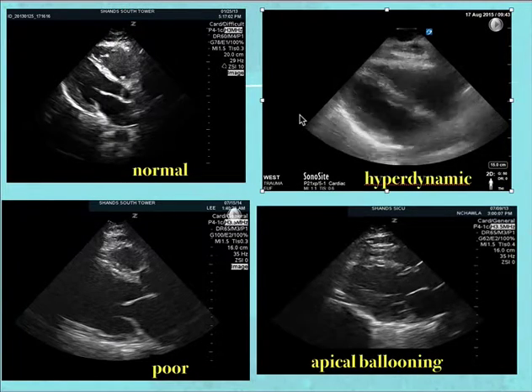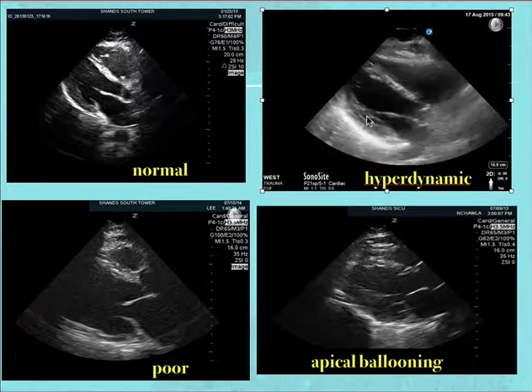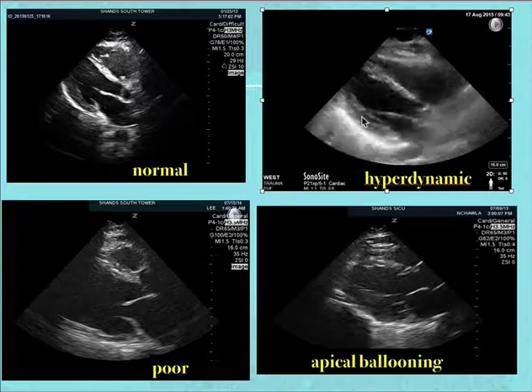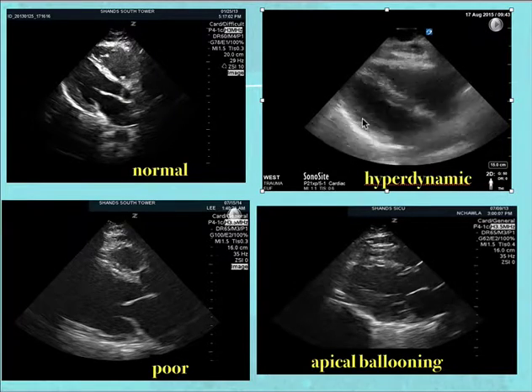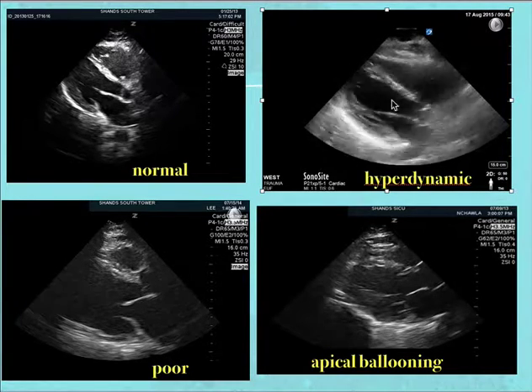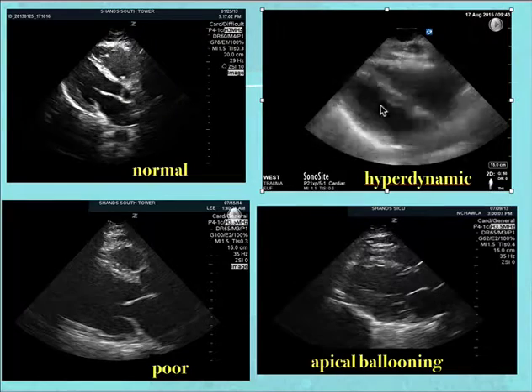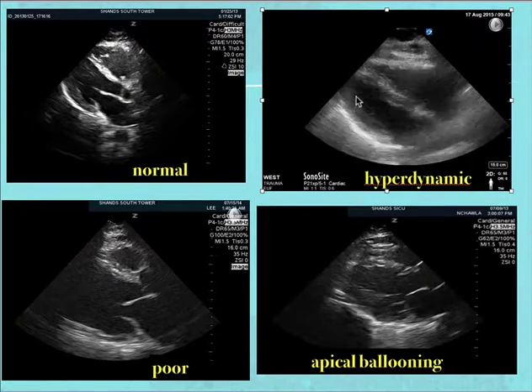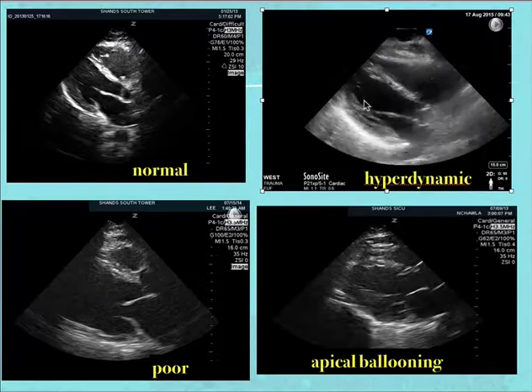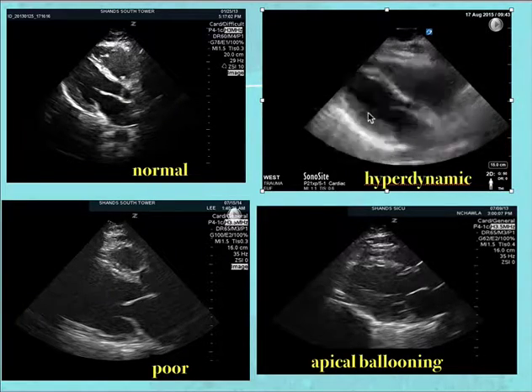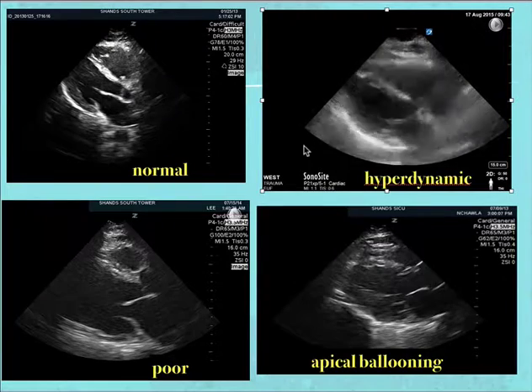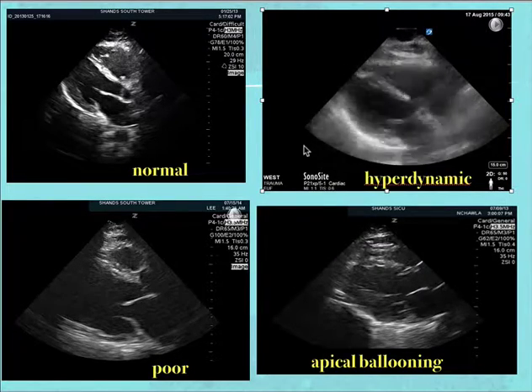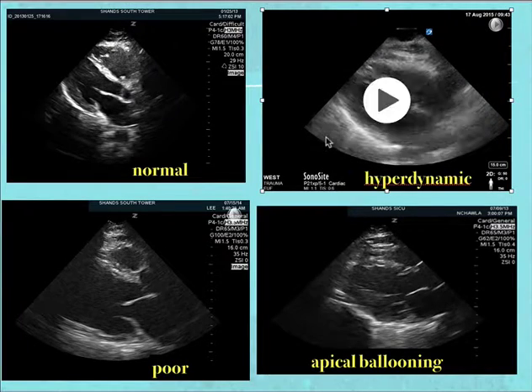Now looking at a hyperdynamic example — the patient is tachycardic, so don't let that confuse you. The mitral valve is vigorously touching the LV wall, and you can see the LV wall collapsing a bit more, especially in the apical region. Remember, you want to be looking at the mid-level, and that's why we'll also look at parasternal short axis images at the papillary muscle level.